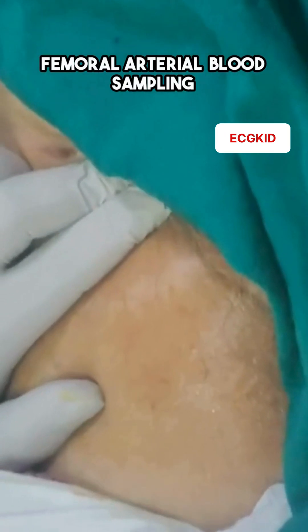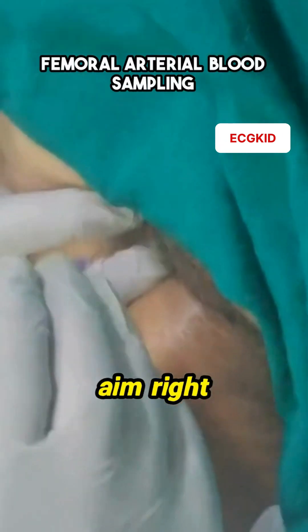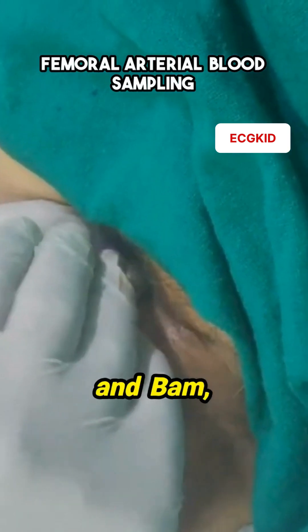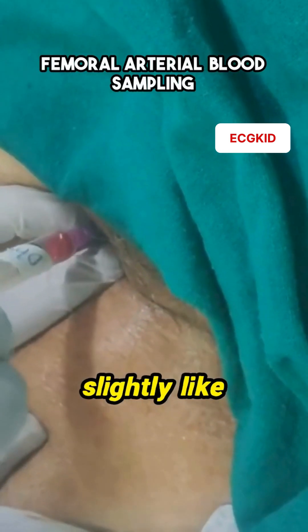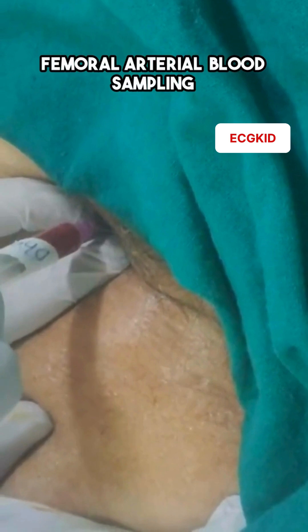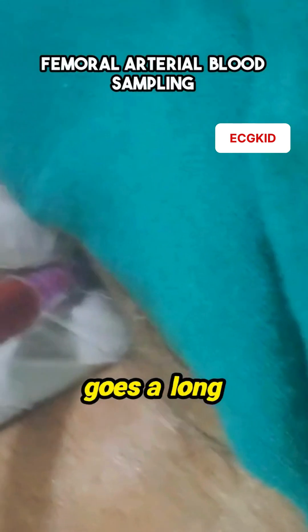Now, here's the wild part. We take the syringe and prick the patient. The trick is to aim right between the fingers where we've been palpating the femoral artery. And — bam — wait, no bam. If you don't hit it right away, just adjust ever so slightly, like two millimeters to the right. And bam, we're in. Precision is key, but a little finesse goes a long way.